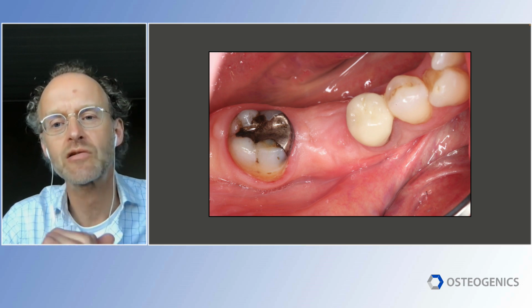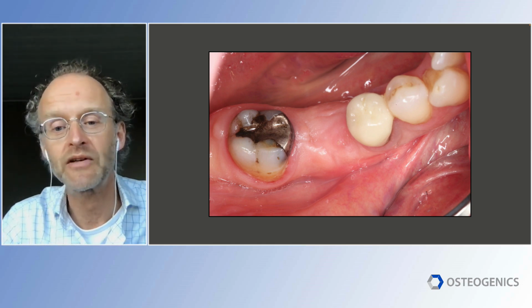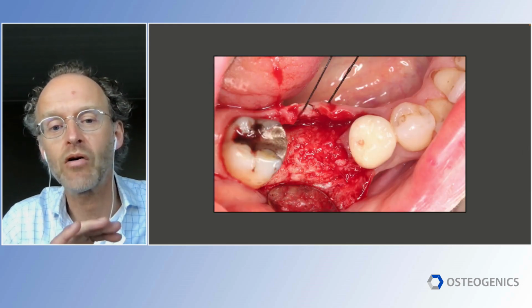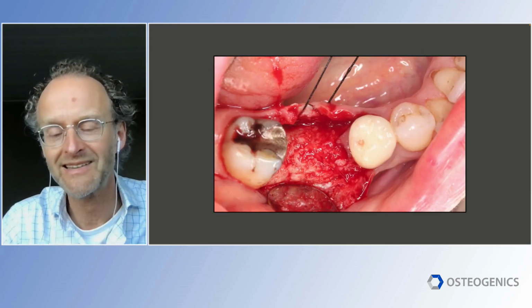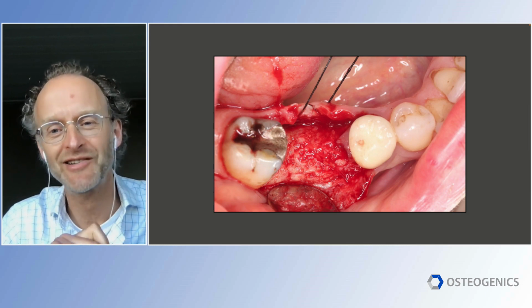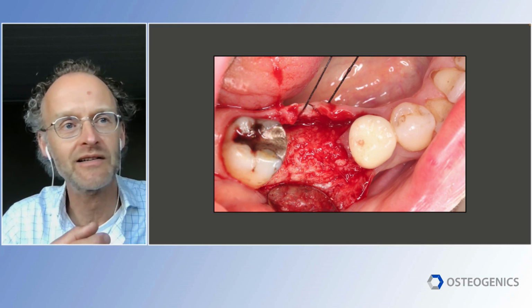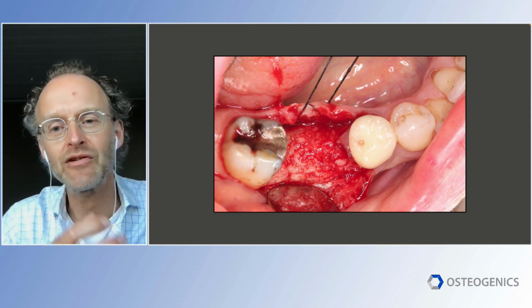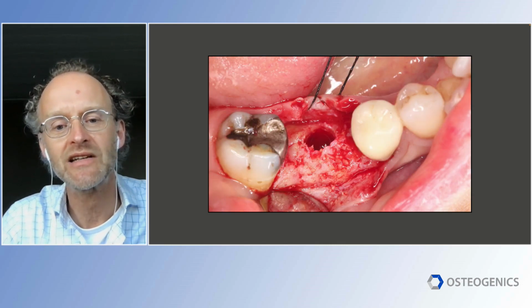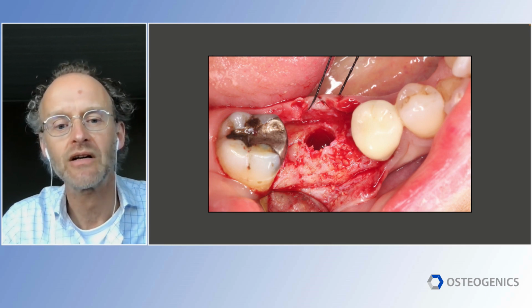We have a luxury amount of keratinized tissue, wonderful. We go and open up the tissue, and the joy is even more because we have fantastic bone. And I often say, now we're going to do the real test of the regenerated material. We're going to drill in it. And now, having been using other techniques, never do you get the hardness of bone which you get with this technique. As you can see in the next slide, really hard bone, sharp edges. It shows it.